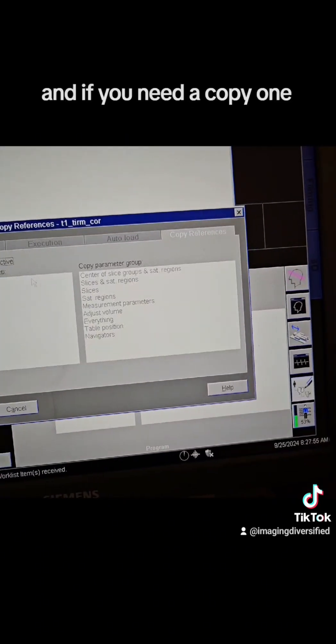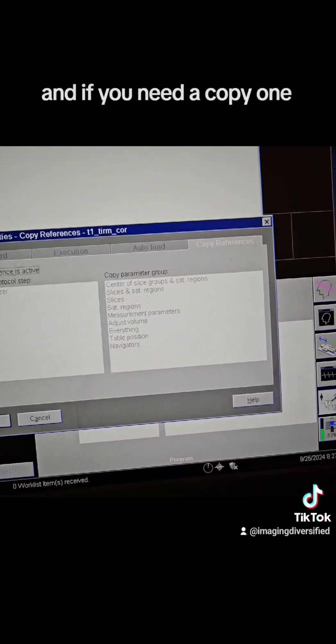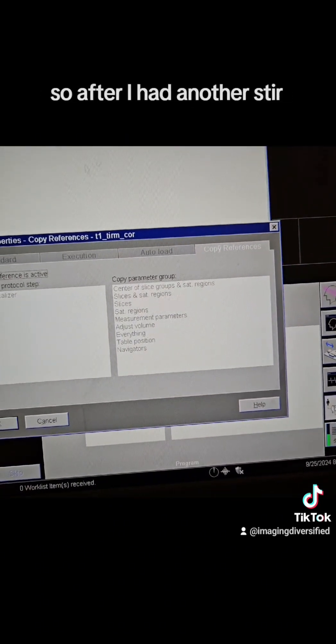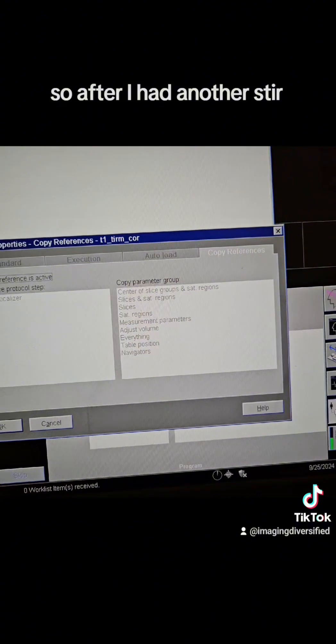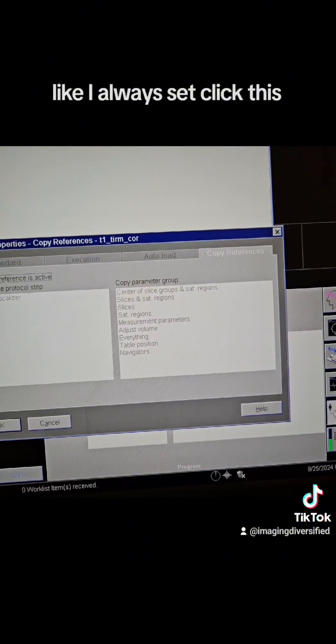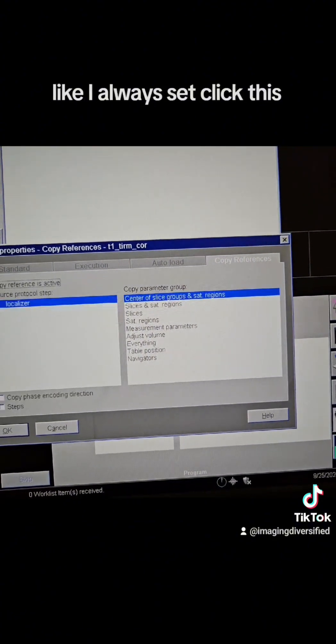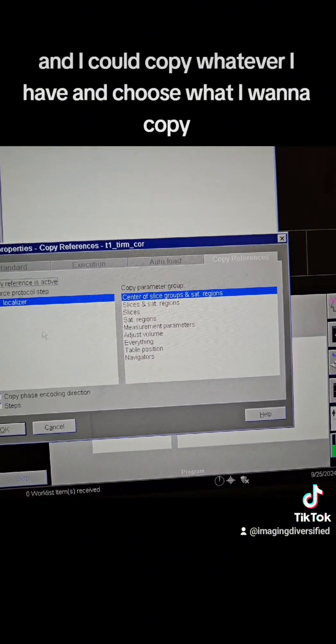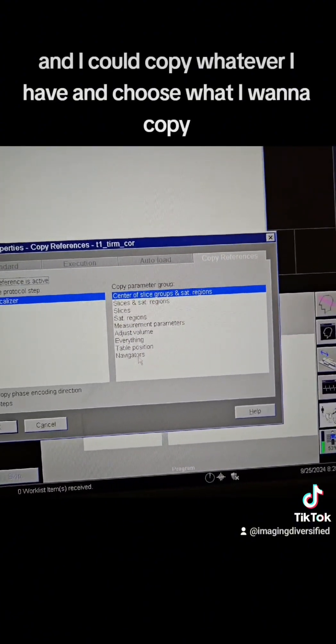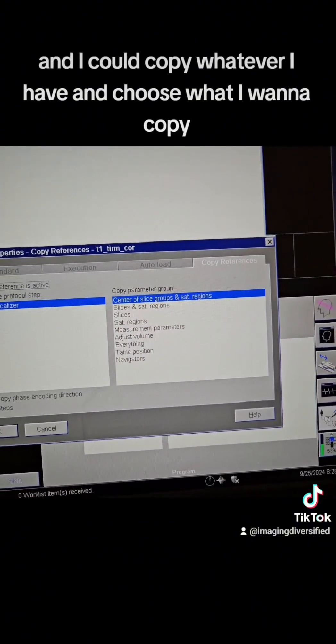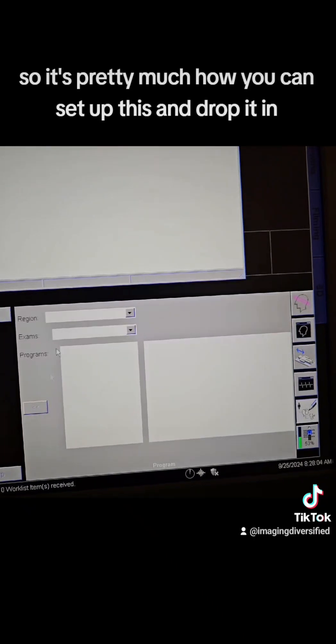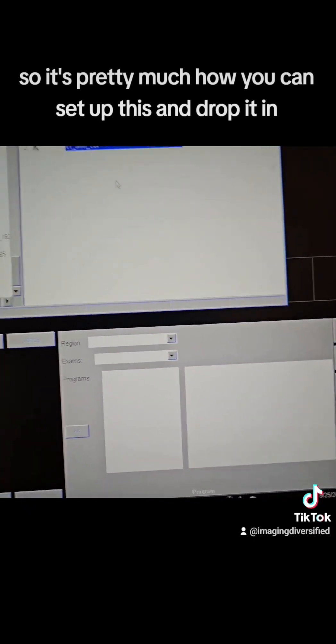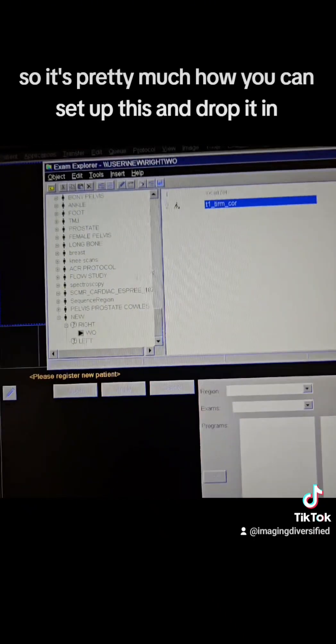And if you need to copy one, so if I had another stir, I could always click this, and then I could copy whatever I have and choose what I want to copy. So it's pretty much how you can set up this and drop it in.